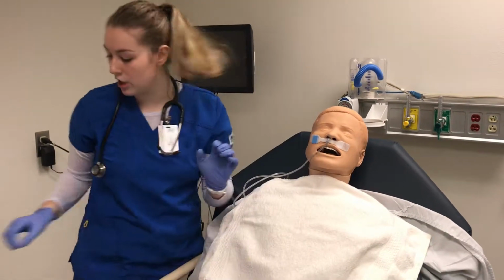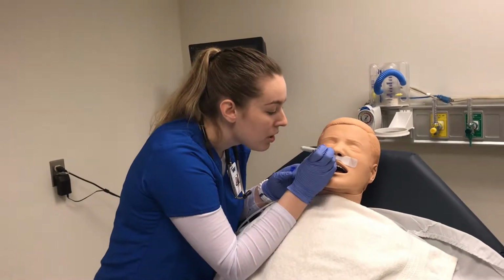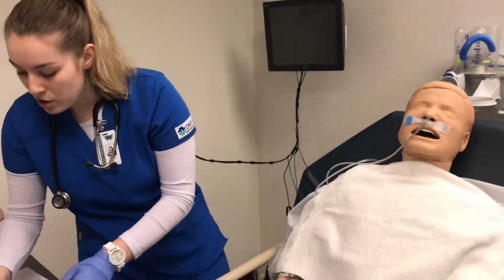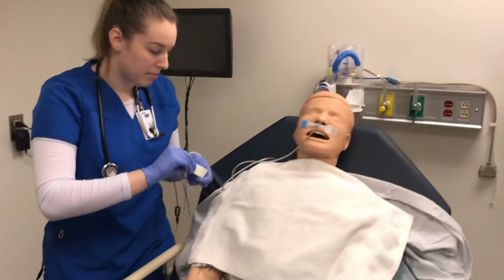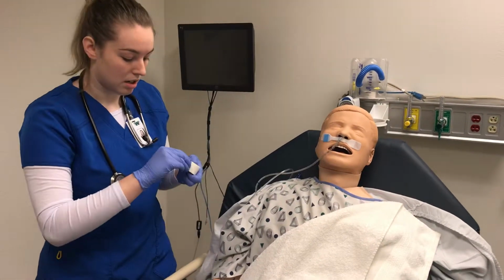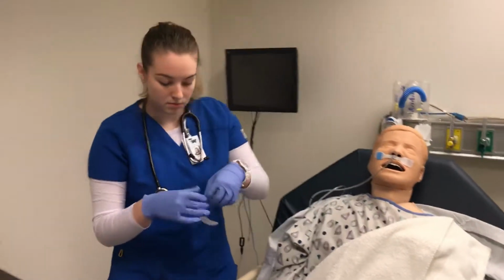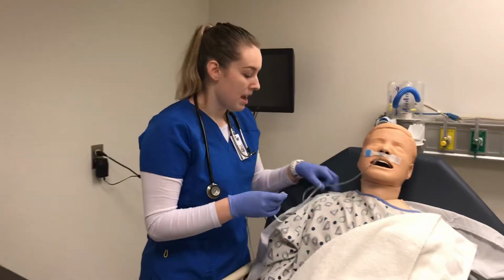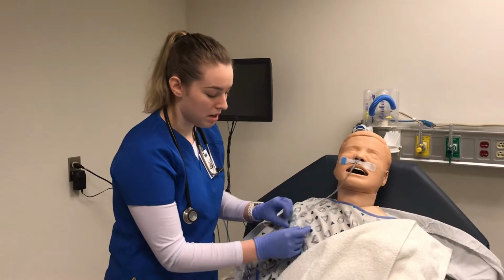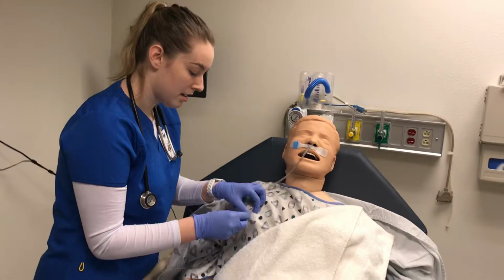Okay, so now that that is secure, I am just going to take my marker and mark where it is in her nose there. Okay, and now I'm just going to secure it to your gown, Shirley, before I continue. So I'm just going to take a piece of tape, and I'm just going to put it around the tube, and then safety pin it to the gown so it stays in place.